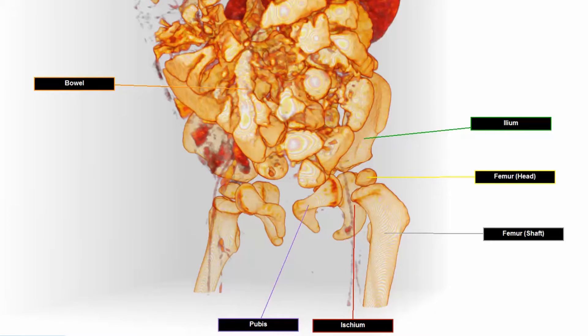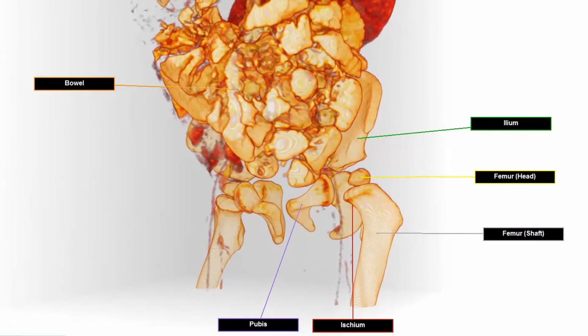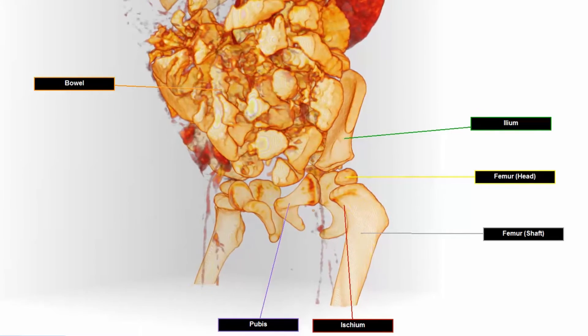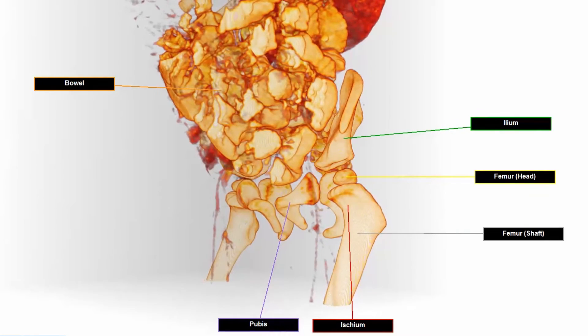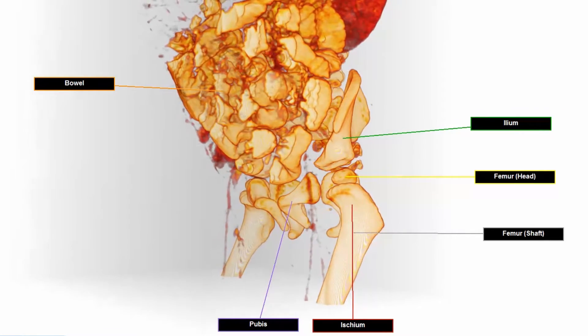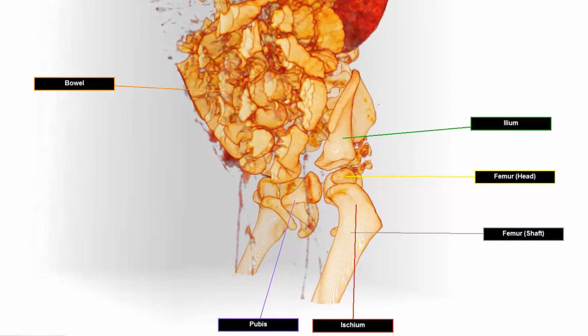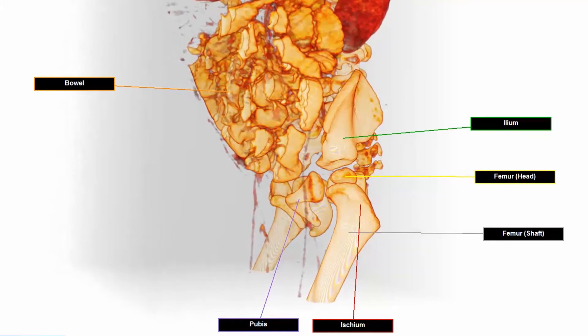I'm going to pan around the volume again, where we can see that the sacral vertebrae and the head of the femur have also not been completely ossified, or turned to bone.